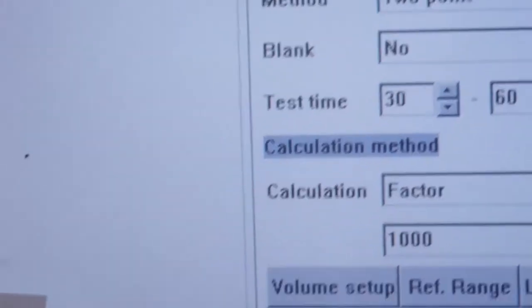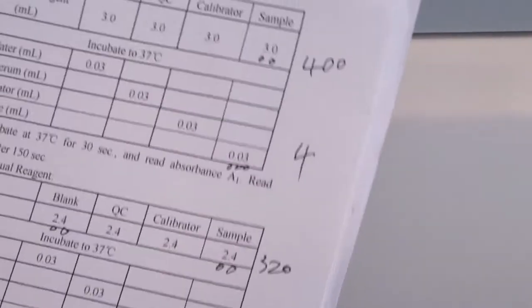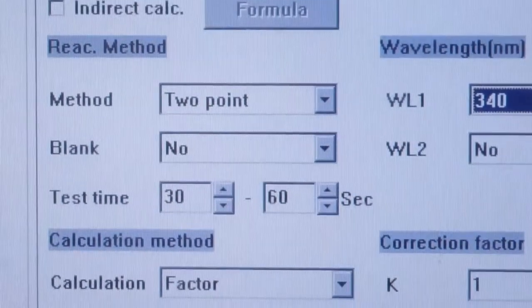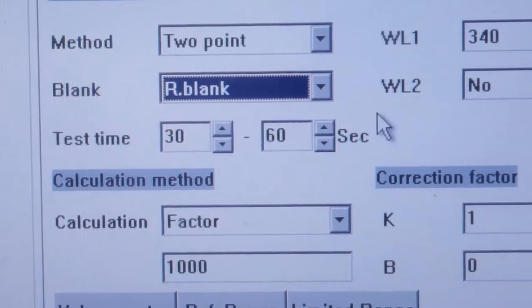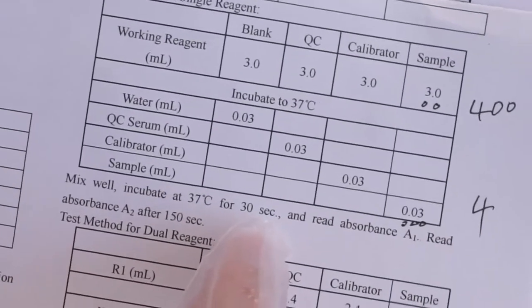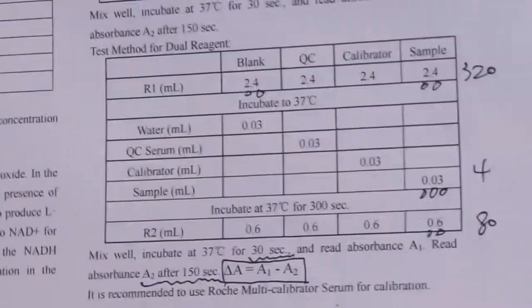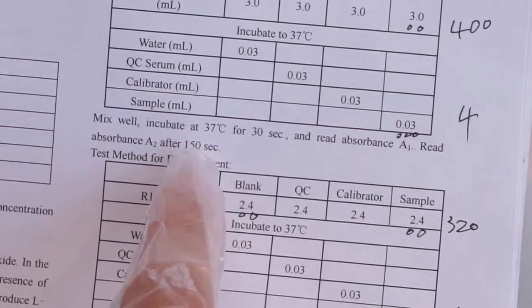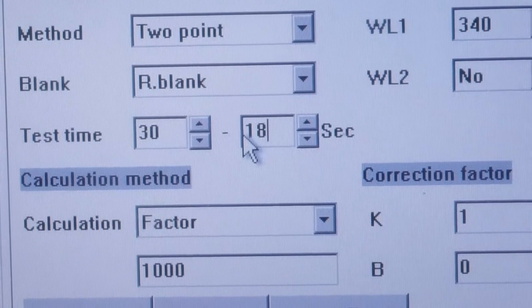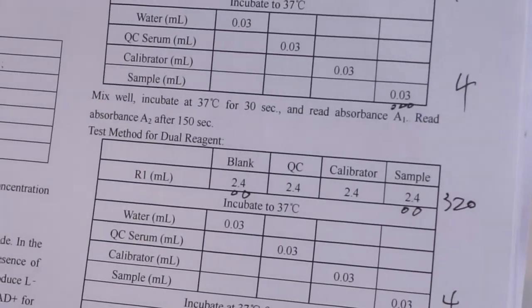And for the blank, you can see the blank. The blank actually is the reagent blank. Also, it is the reagent blank. Choose the reagent blank. The test type, you can see in here: mix well, incubate, and this is dependent on 30 seconds, and read absorbance A1. So this incubate time is 30. And the reading of absorbance after 150 seconds, so this one we input 180, because we need to add 30 seconds to this one, the test time.